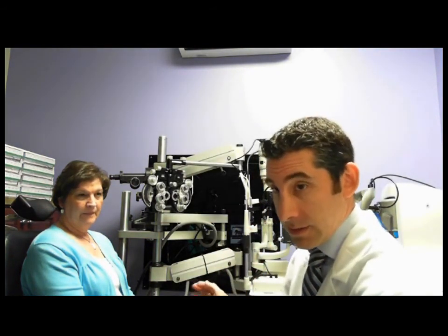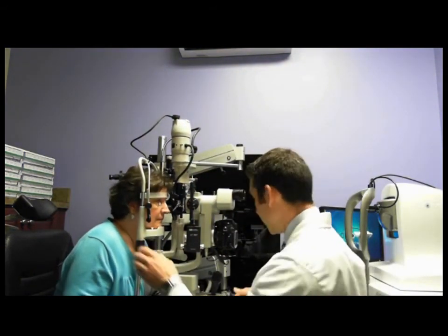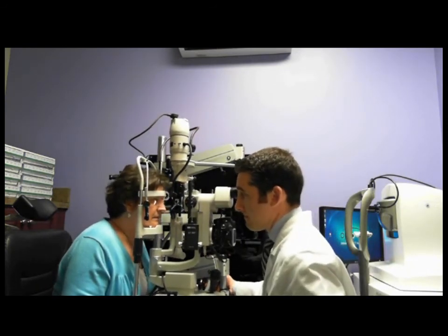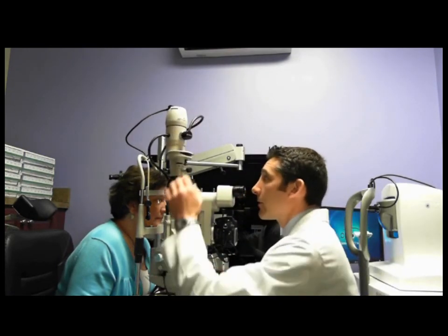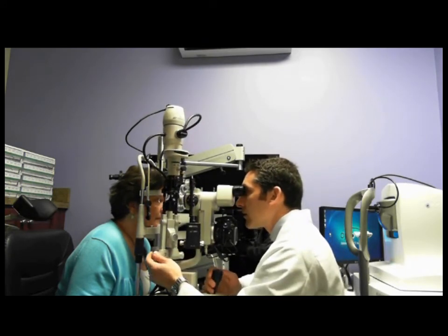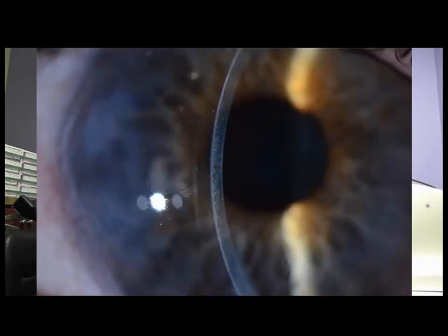We're going to check that out to see if that's the case with both the slit lamp view and the OCT. So let's take a look here. Does this need to come up a little bit? Just a little. Okay, so the first thing we're going to do is we're going to inspect the vault centrally. Let's get a little bit of a mag. Centrally, we have vault over the central cornea. Let's see if I can make this image a little bit better.